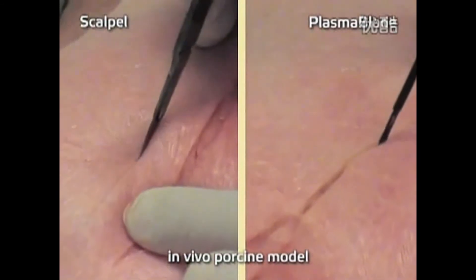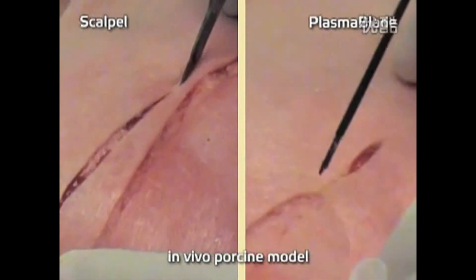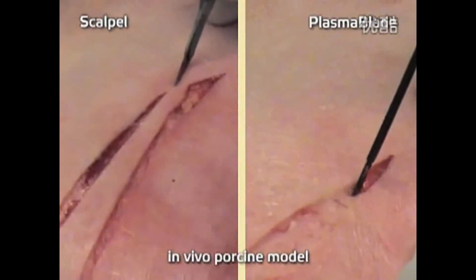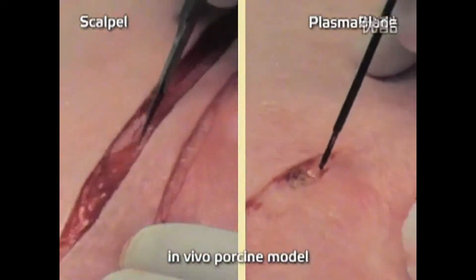The Peak Plasma Blade provides the best of both worlds in a single tool. It reduces bleeding by 60% compared with a scalpel, and generates half the heat of traditional electrosurgical devices.